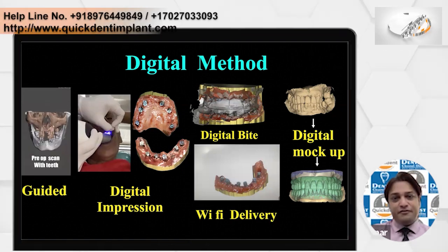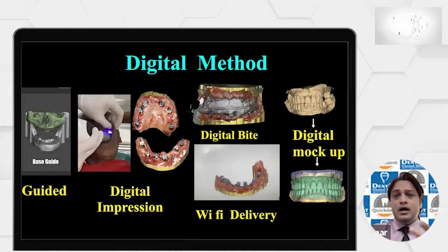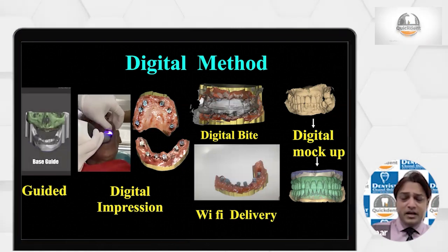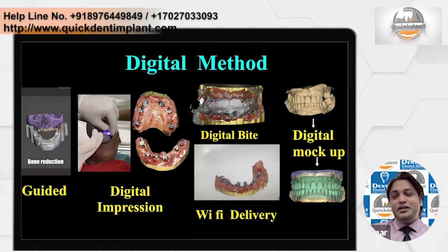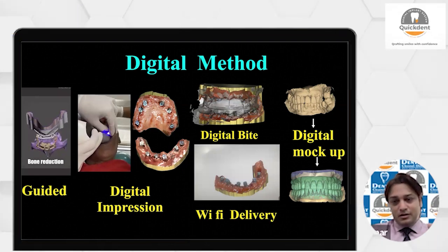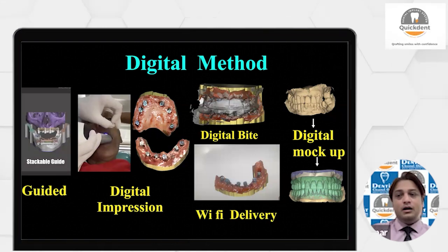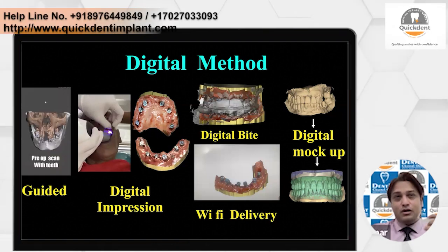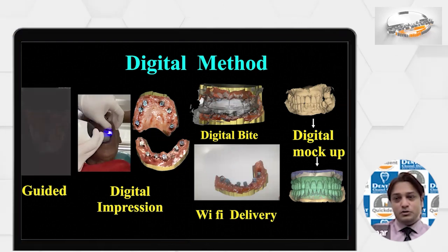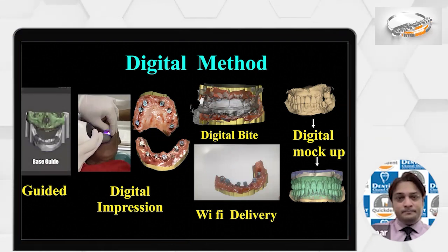So it is better to verify it in the patient's mouth on day 2 or day 3. Another advantage is that many times you can do a digital bite, and your delivery is not physical, but rather Wi-Fi delivery. And of course, you can use digital mock-ups, which is a more important thing compared to manual mock-ups. So digital mock-ups are easier. You don't have to worry about this.